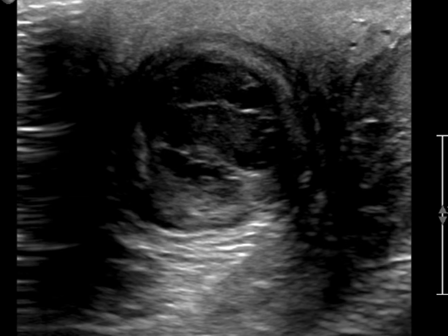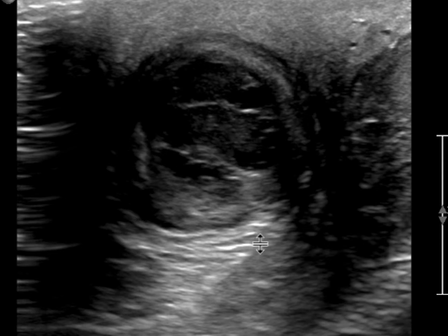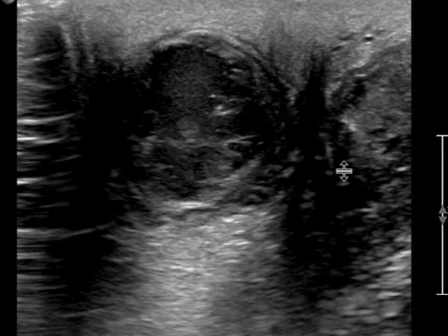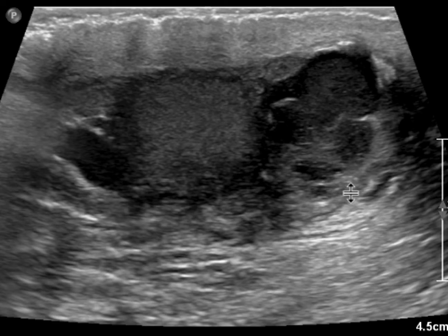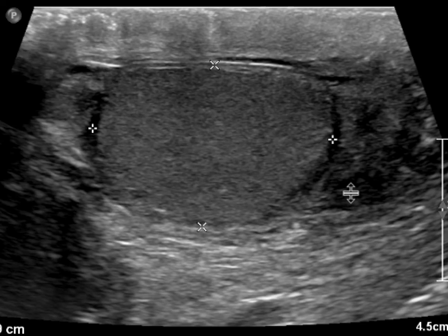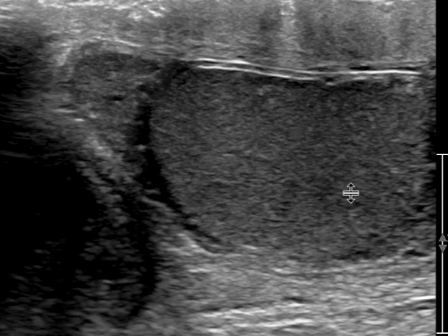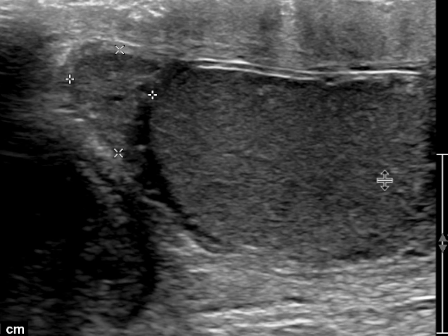As we get inferior to the right testicle, we start to see this complex mass with septations, low-level echoes, some thickened borders, and some hyperemia around the periphery of it. We'll come back to that in a little bit as we finish looking around the testicle to evaluate the epididymis.